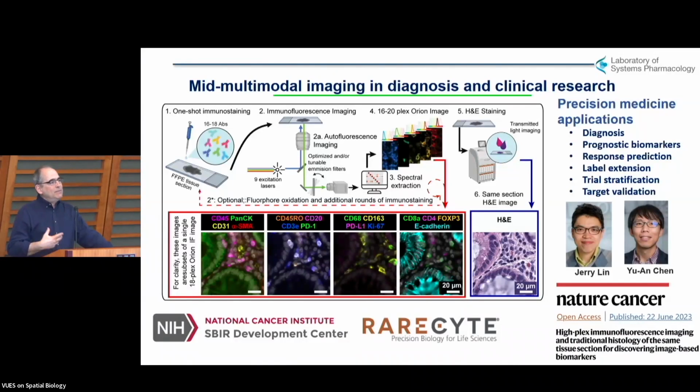And so that's the type of data, either from this or other platforms, that we're likely to see coming in volume. And this leads then to the last point about the computation: now we need to figure out how to bridge those worlds between what the pathologists, to my knowledge, call the sexyplexy, which is whenever it's more than 2-plex, and the H&E.